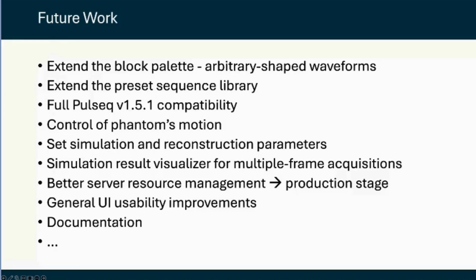But again, this is not very easy or very direct. Then, of course, general usability improvements, and documentation, for sure. We have to work on that, as it is essential nowadays, and maybe many more improvements that may come up from people using the tool.